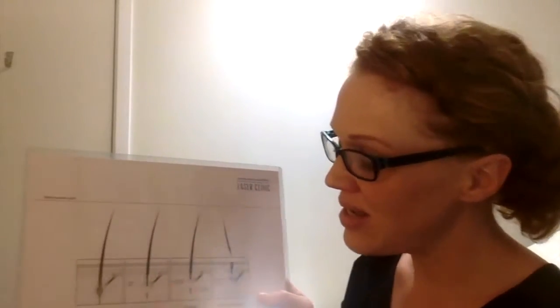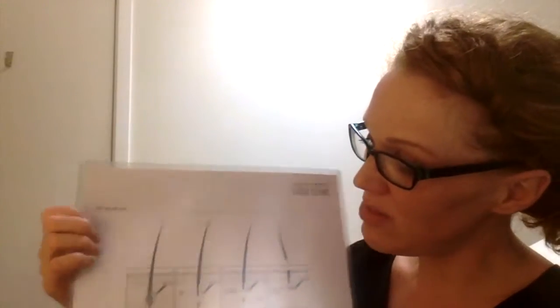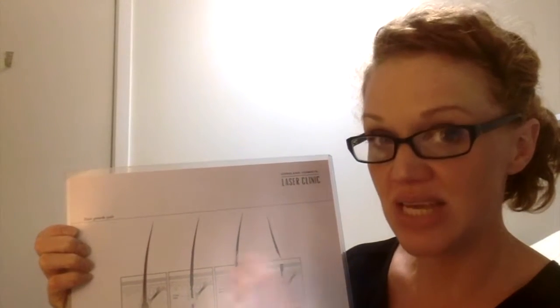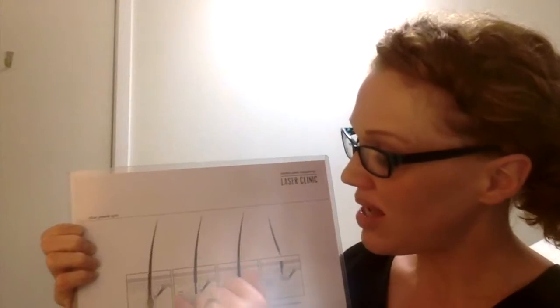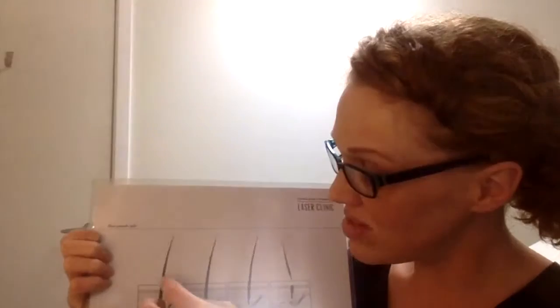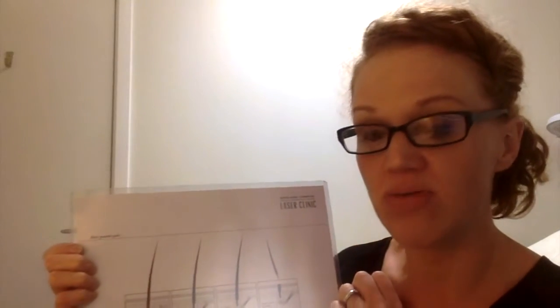We do shave the hair prior to treatment. If the client's been waxing, we need to wait a few weeks for that hair growth to all be present again. The reason we shave is for safety, because we don't want a long length of dark hair sitting on top of the skin surface and getting cooked along the skin. And for efficacy, because if we shave off that hair right at the skin surface, it means all of the energy from the laser is being absorbed straight down into the hair follicle, so they'll get better results and have a safer experience.